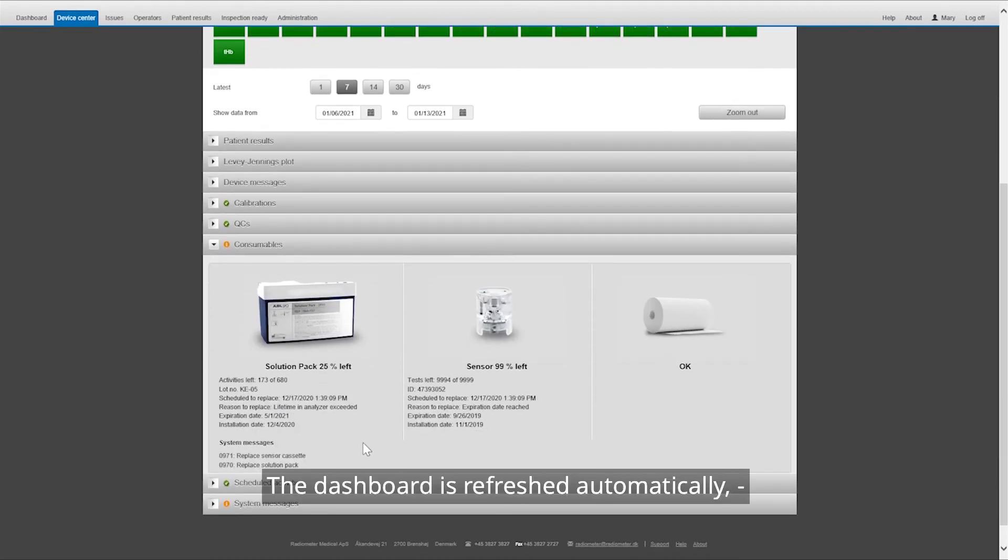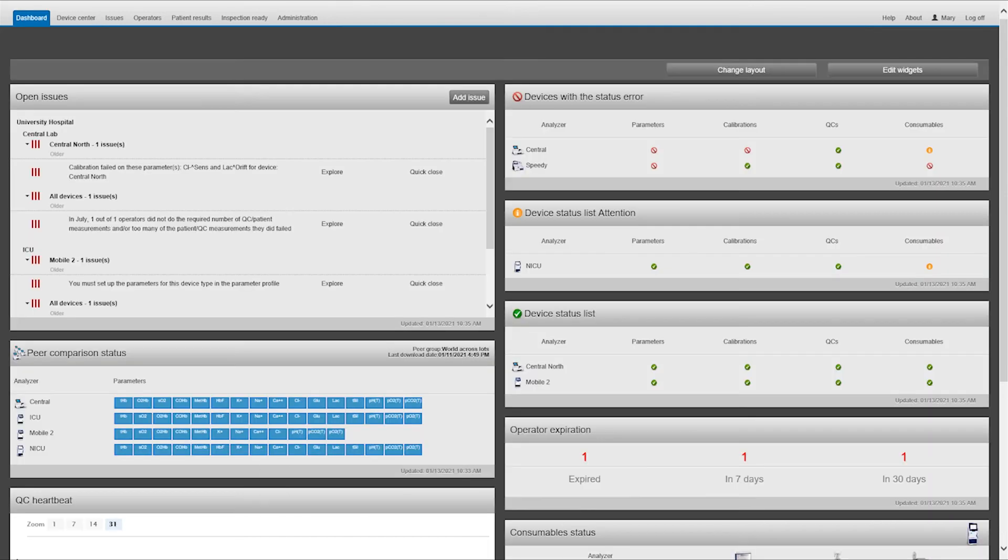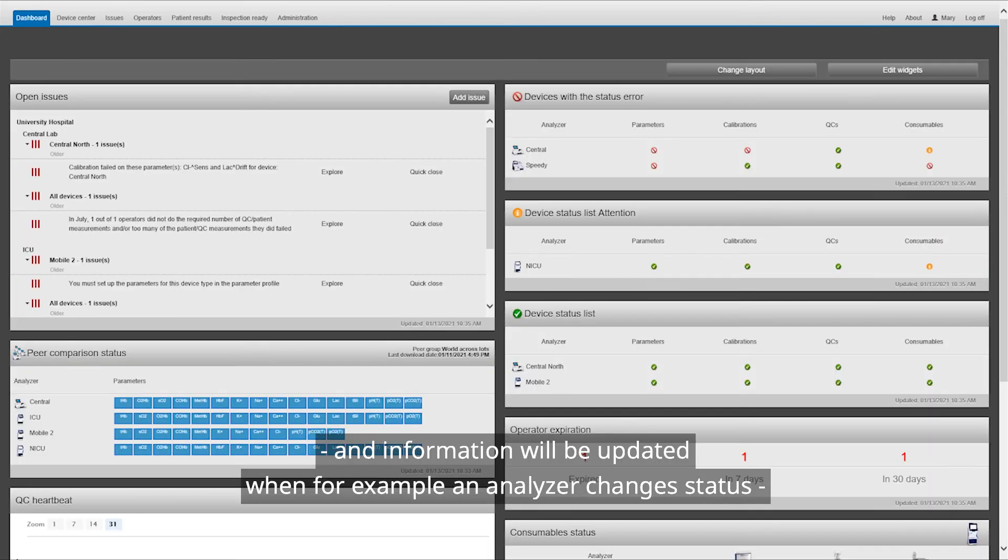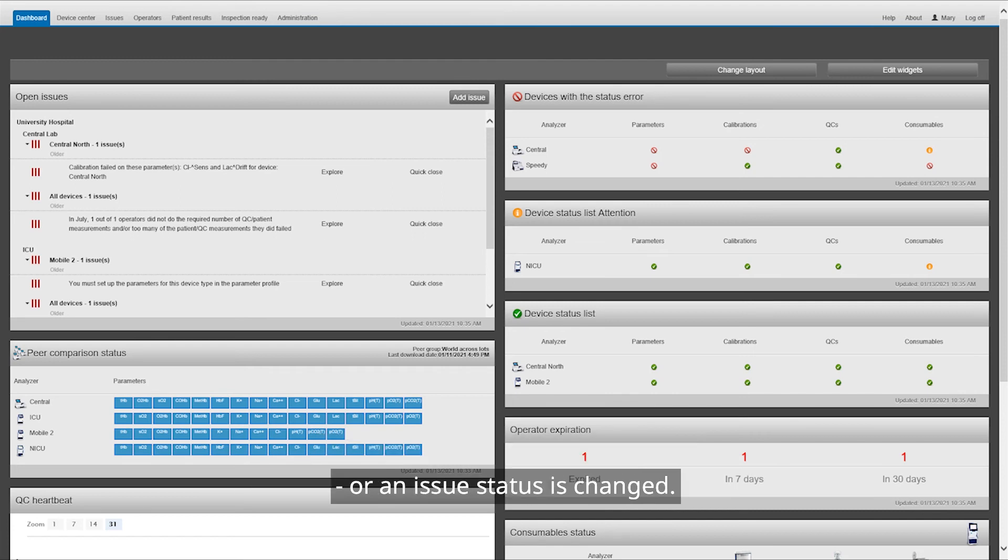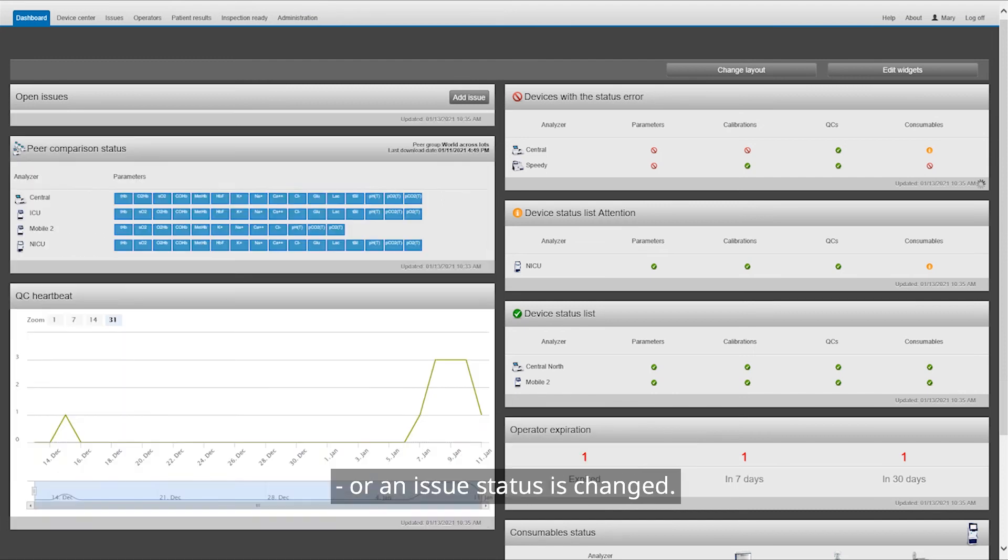The dashboard is refreshed automatically, and information will be updated when, for example, an analyzer changes status or an issue status is changed.